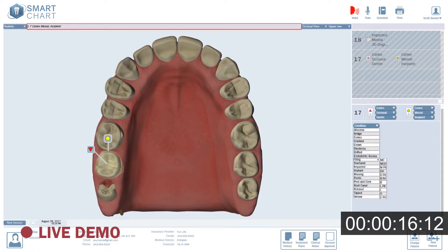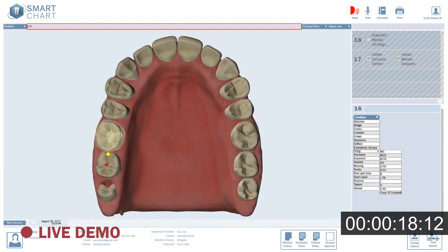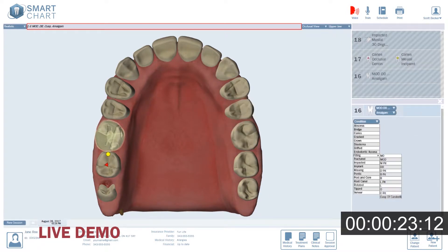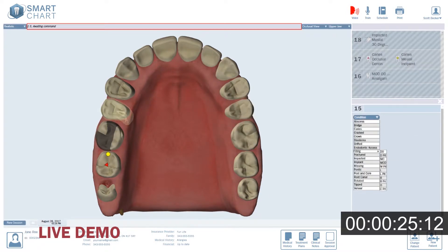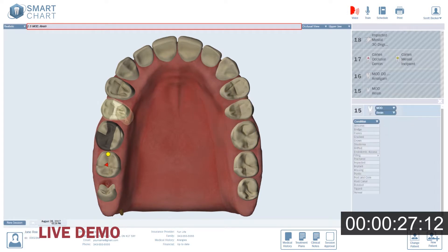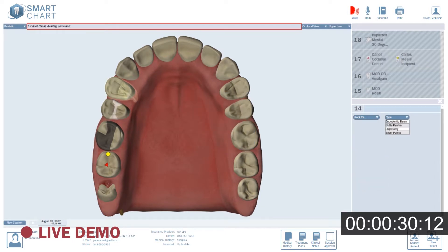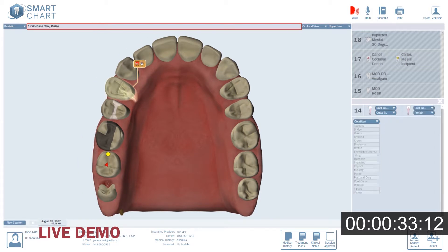1.6: MOD, distal buccal cusp, amalgam. 1.5: Mesial occlusal distal, resin. 1.4: Root canal, gutta-percha, post and core, prefab, crown, PFM.